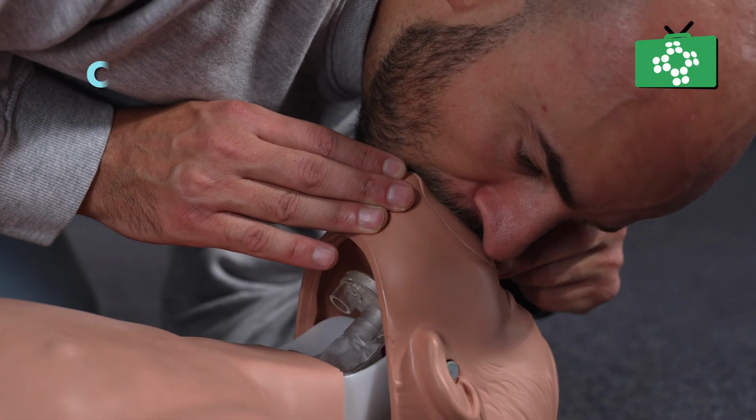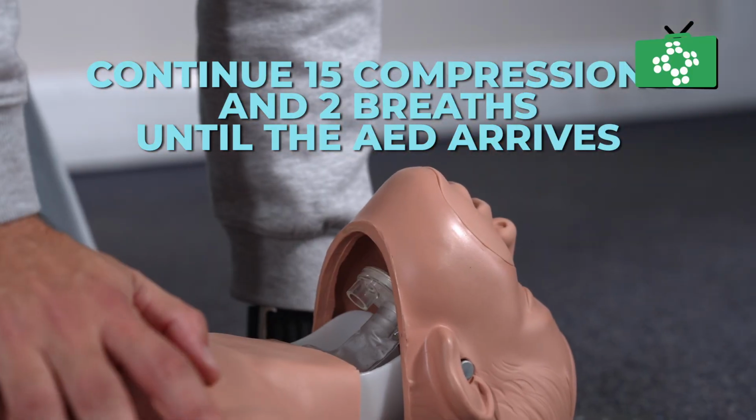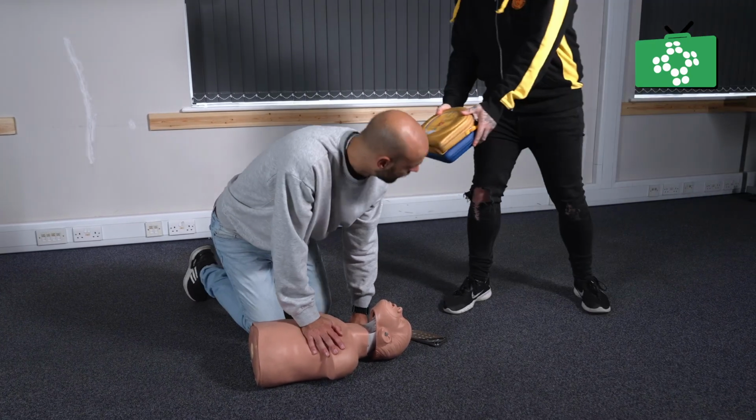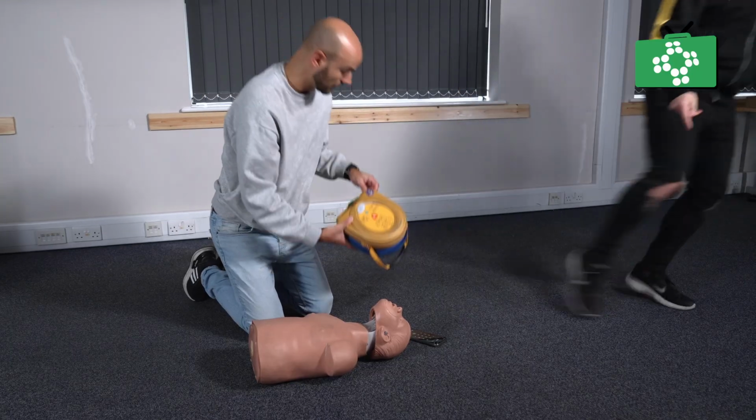Continue CPR at 15 compressions, then 2 breaths until the AED is attached. Do not pause compressions while someone is fetching the AED. Use the AED as soon as it arrives. Switch the AED on and follow its voice and visual prompts.